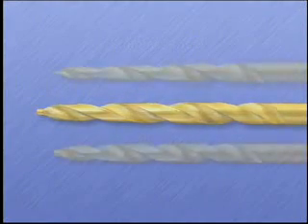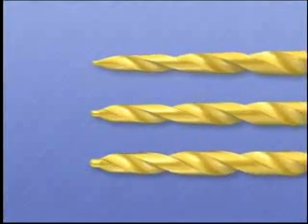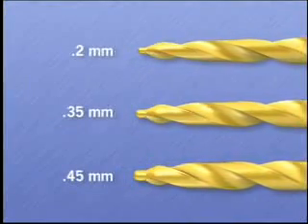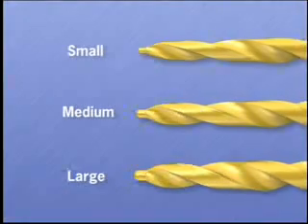These LA access burrs come in three sizes varying primarily by their tip diameters. Numbers 1, 2, and 3 have pilot tip diameters of 0.2 millimeters, 0.35 millimeters, and 0.45 millimeters. These burrs are used in small, medium, and large roots respectively.